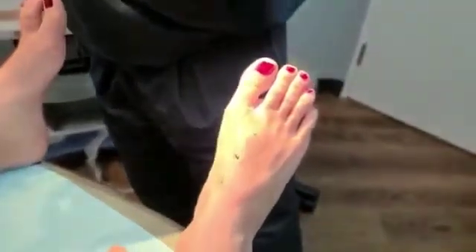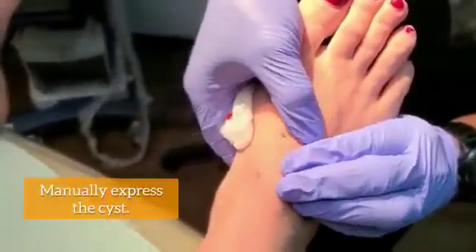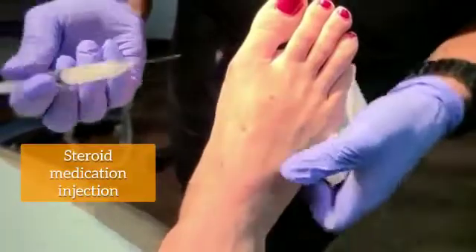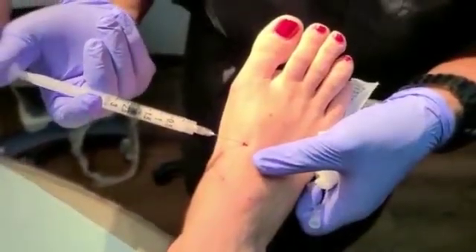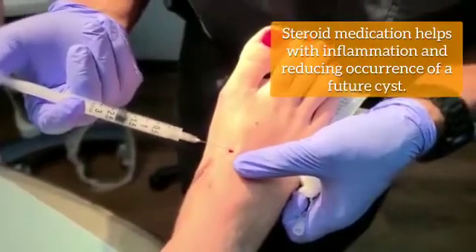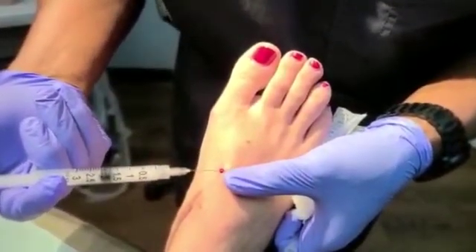We're not done yet. I always say the enemy of good is better, so let's get more. Let's see if I can express any more — it's pretty good. Now we take a little steroid medication and inject it into the cyst to keep it calm. Because everything I just did is going to make the area a little bit angry. So we put a little steroid in there to help calm down the inflammation and the irritation, and also hoping that the steroid medication will actually scar up a little bit of that trunk and allow that cyst to not grow back.